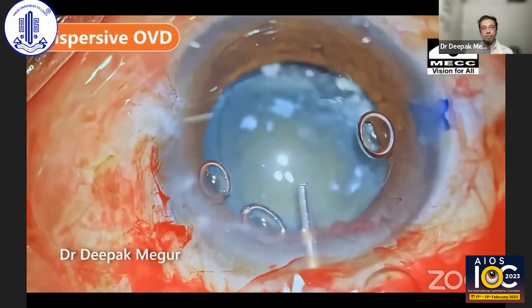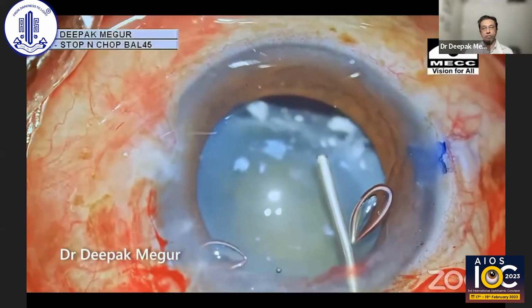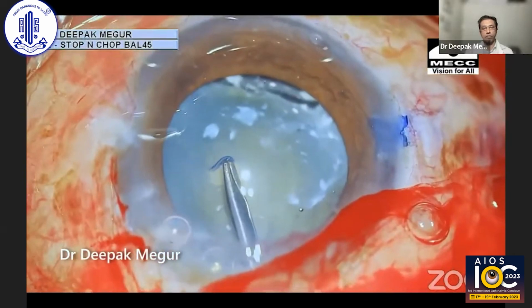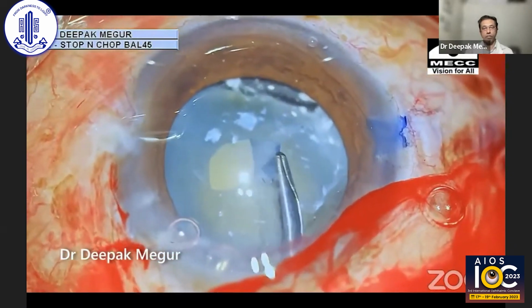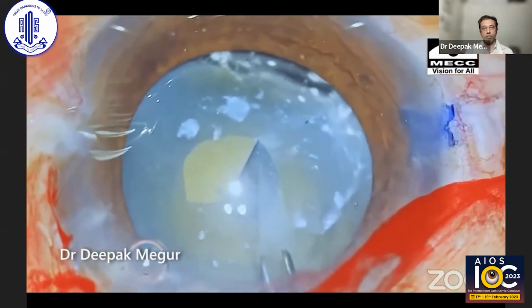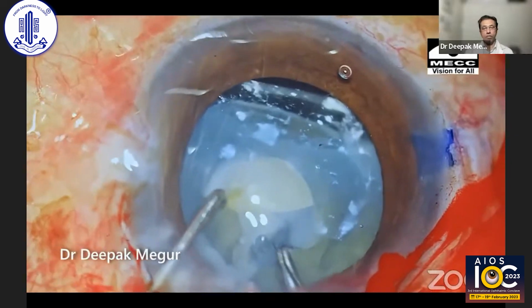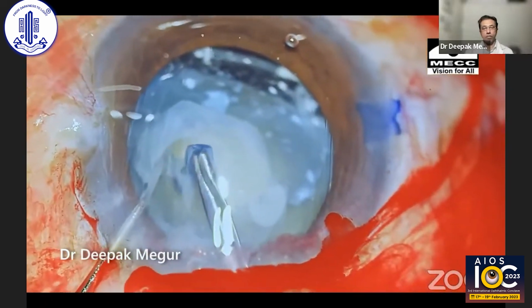So I blocked that area by using dispersive OVD, which acts like a tamponade and barrier. And I'm now continuing with my rhexis. The plan is to perform an initial small rhexis, but as I hit these calcific areas, again, it becomes a little bit difficult for me to tear, but nonetheless, I could get hold of a very small rhexis.